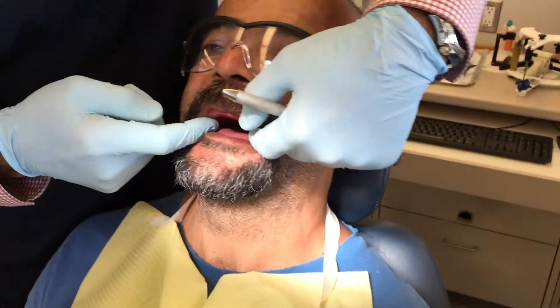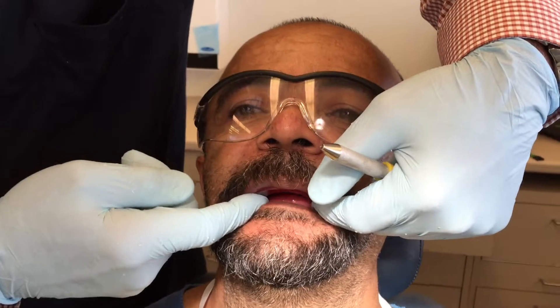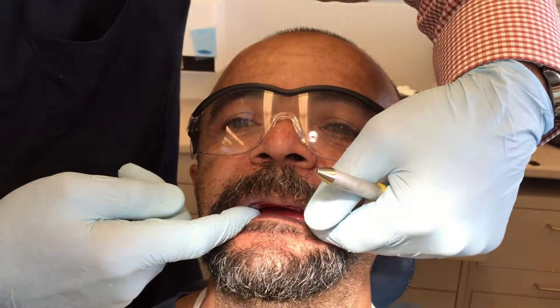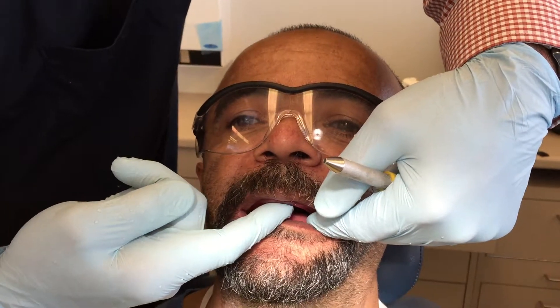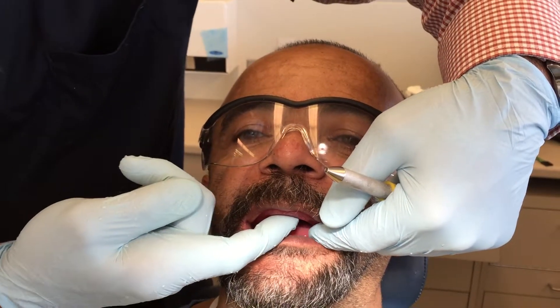We're going to check the stability first, so we're going to try to rock this from left to right. That looks pretty good — his whole head is moving, so that's a good indication. I'm going to try and dislodge it here. That's not coming out, so this is good.